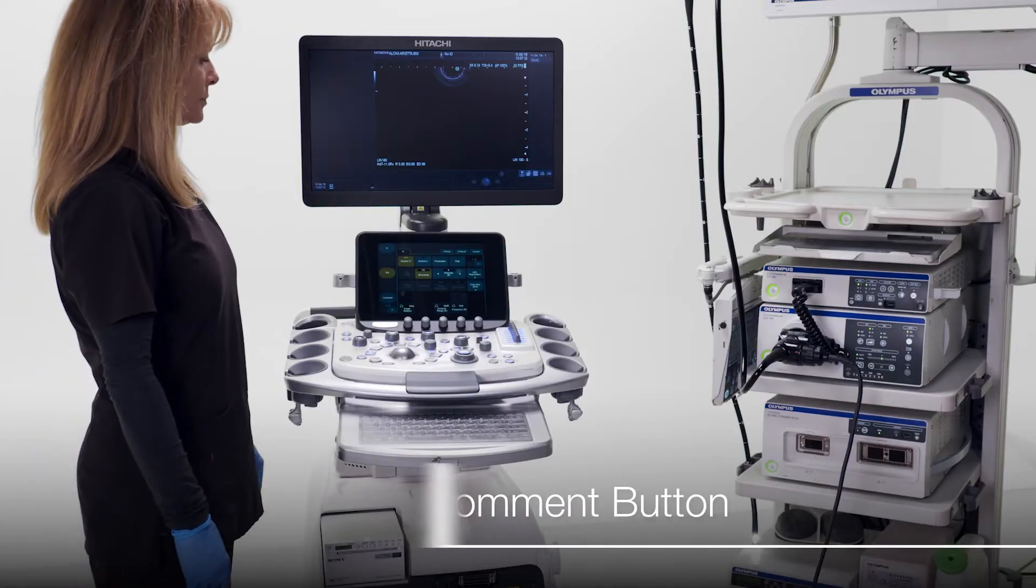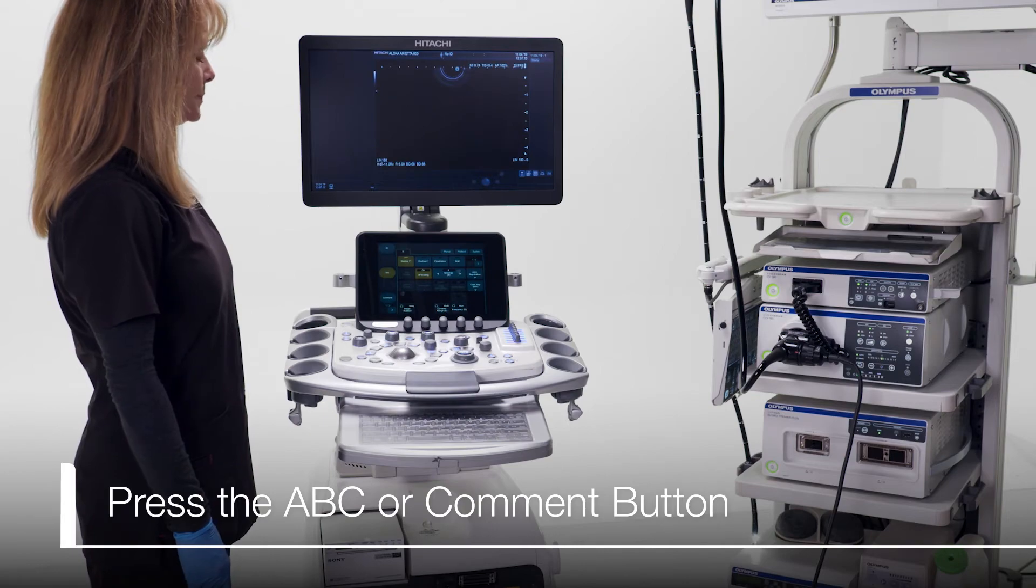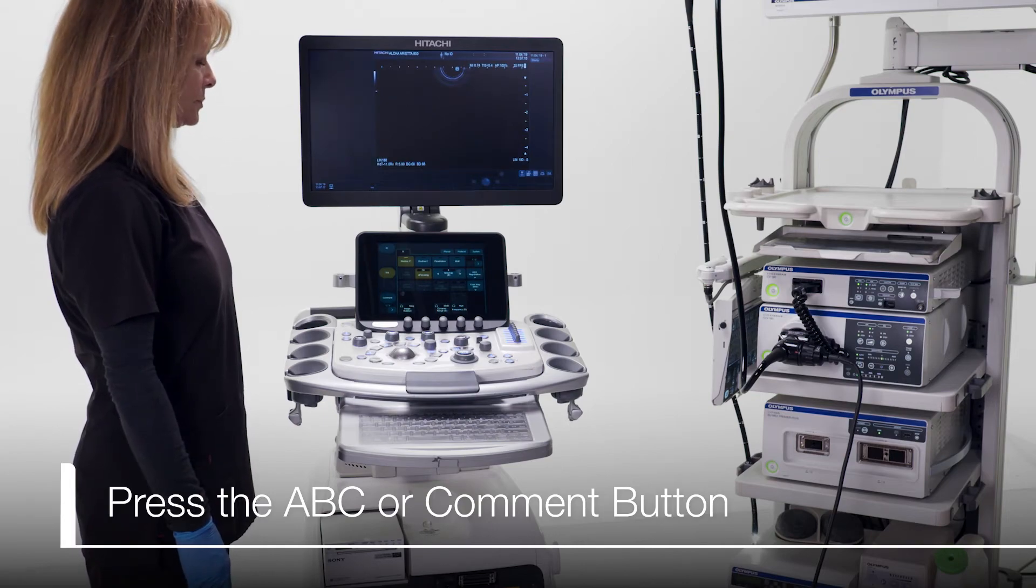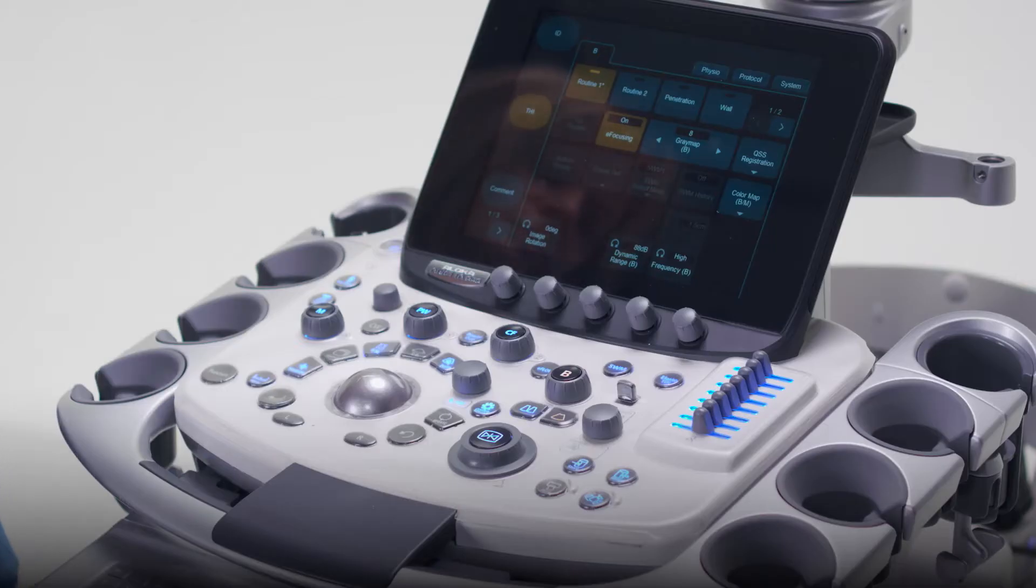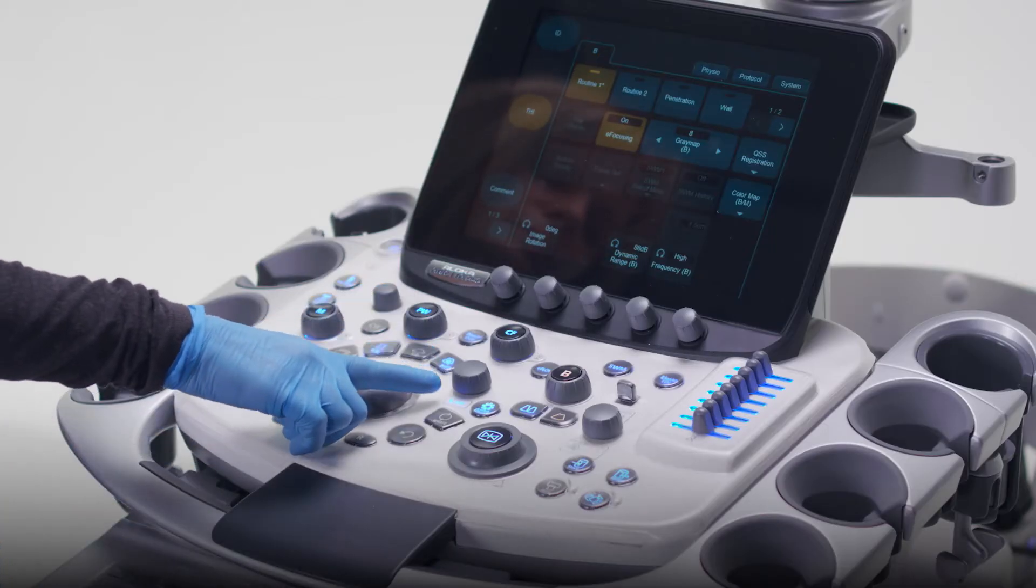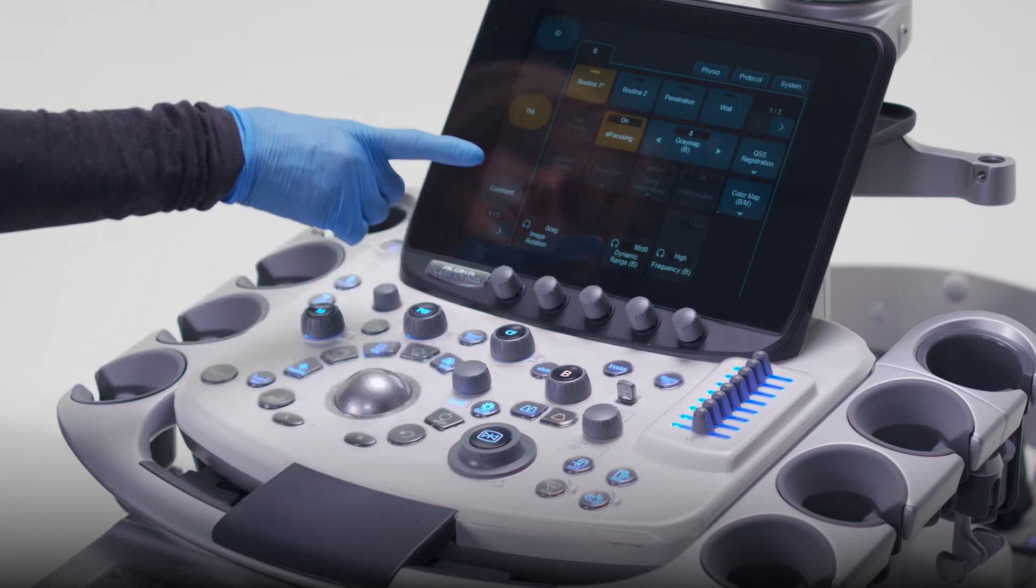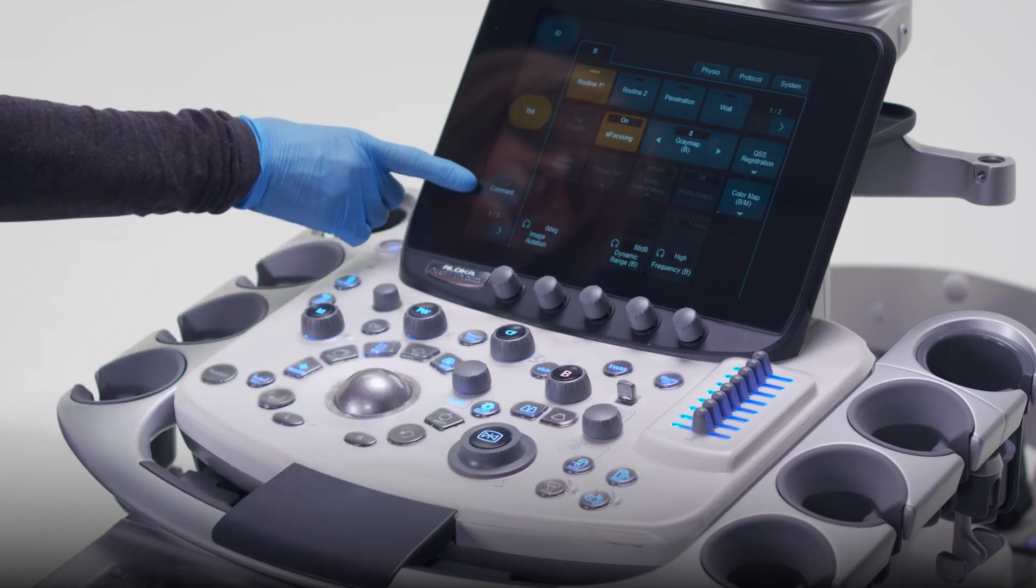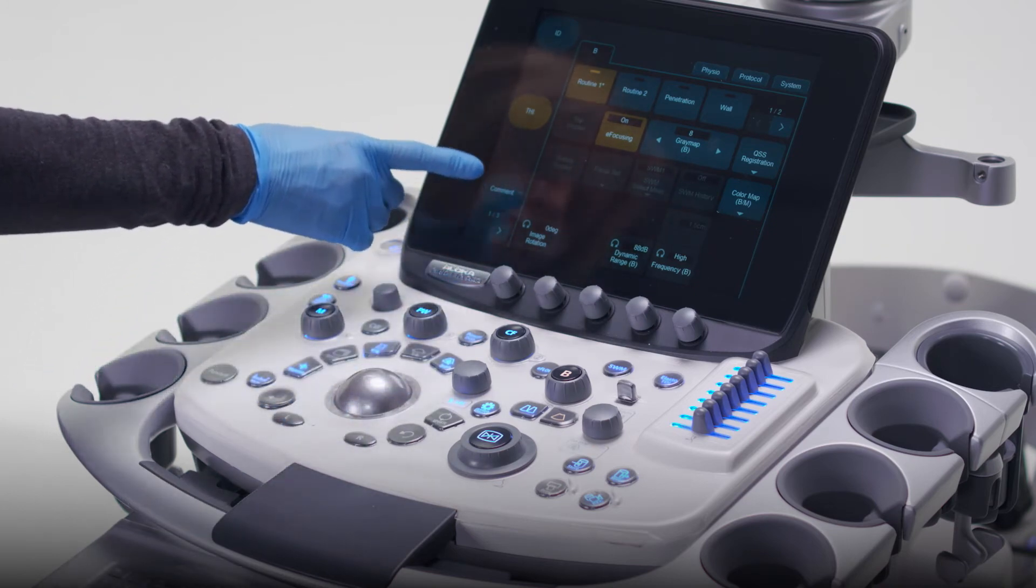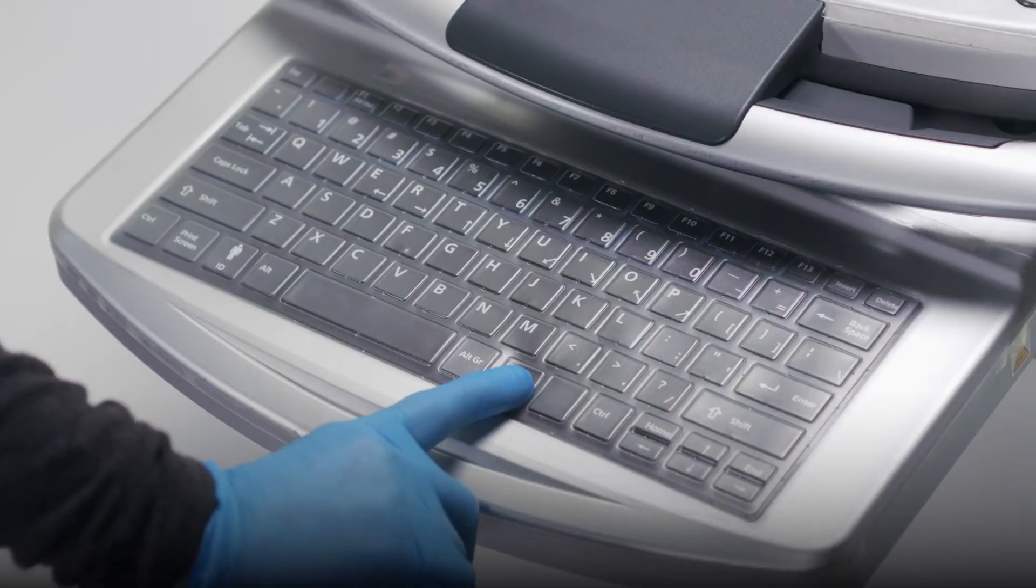Before you begin, make sure you have a scope plugged into the Arrieta 850. Press either the Annotation ABC button on the main console, the comment button on the touch screen, or the comment button on the keyboard.